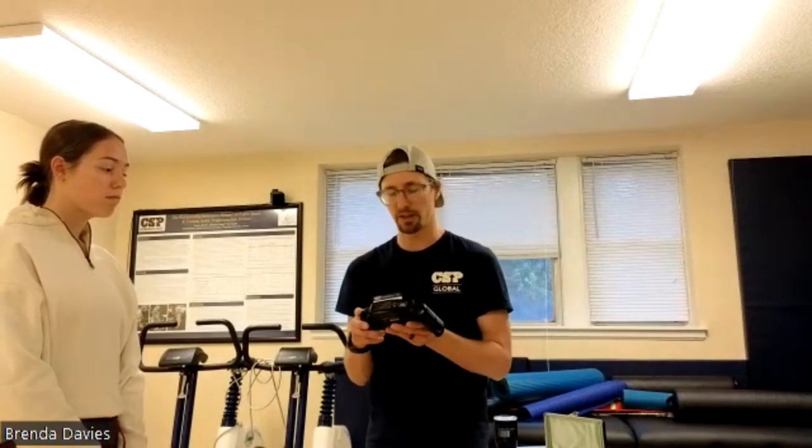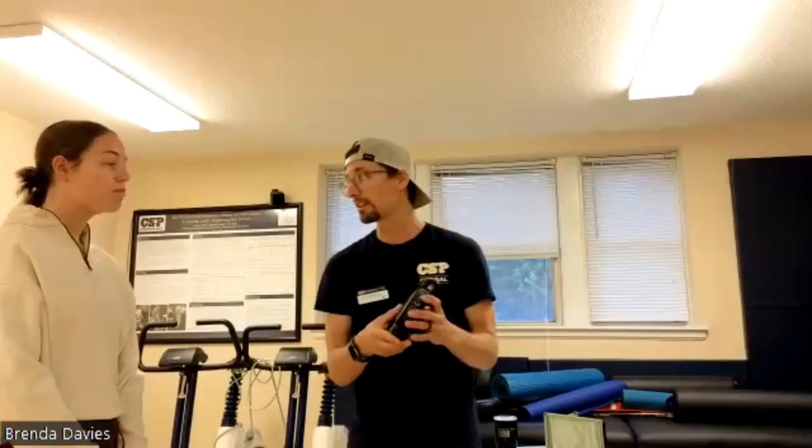So then we'll start the next one. We're gonna make you an athlete this time. Automatically, it's pretty awesome. You just decide you're an athlete on here, you're an athlete. So there we go. You're gonna be 5'6". Go back to 19.